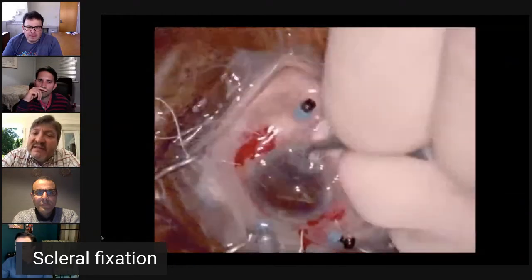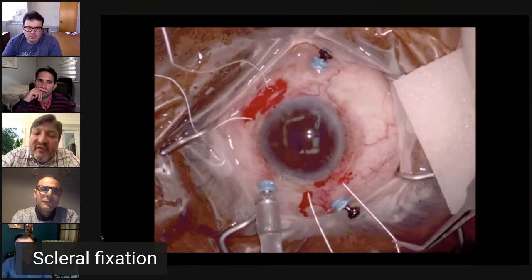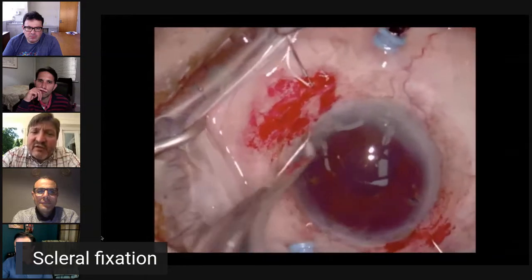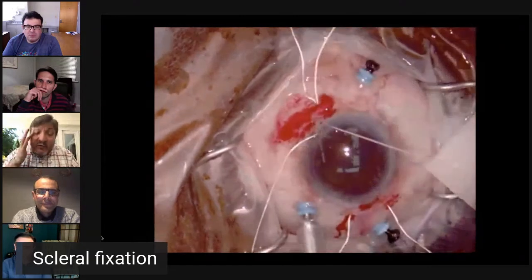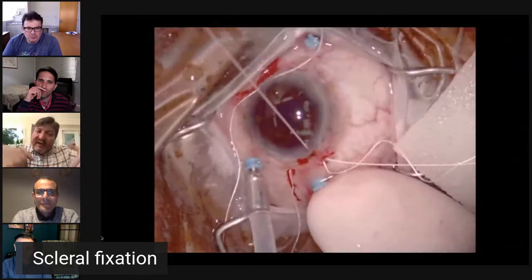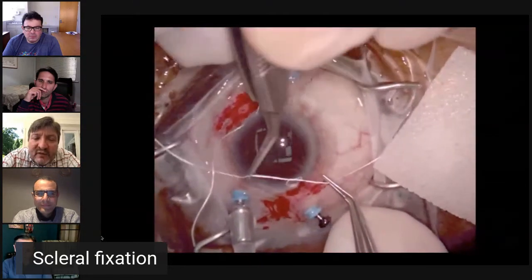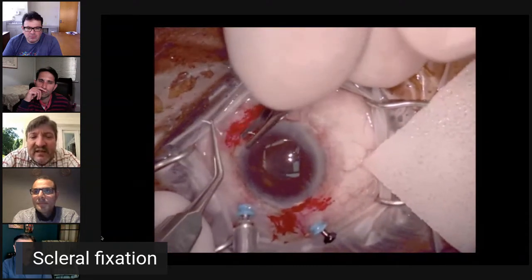But I can fold the lens, and here, remember I said make the wound a little bit larger. I was all about making the small wound here, folding the lens with an old lens folder, lens inserter. And now I'm taking the Gore-Tex suture and I'm passing it through the conjunctival opening that it came out, back in and out through the Hoffman pocket, so now we're through one and a half scleral thicknesses holding that Gore-Tex suture. I can tie the Gore-Tex suture. I tuck the Gore-Tex knot into the Hoffman pocket.